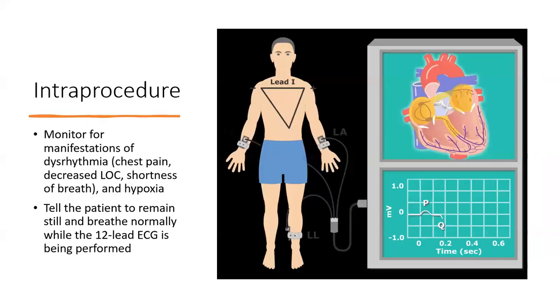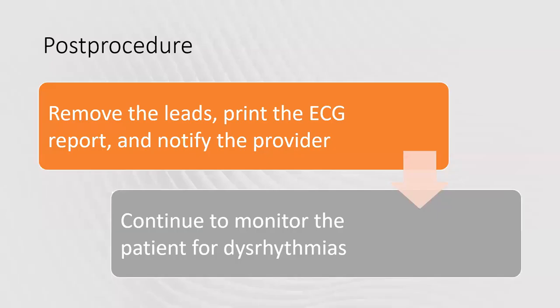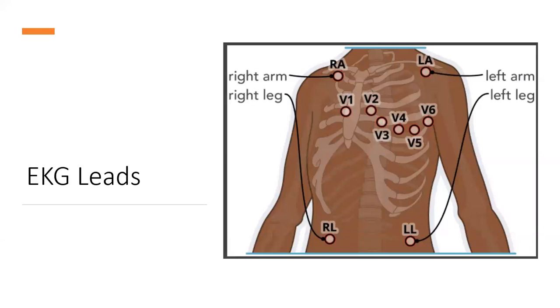So you do want to be careful with where you're placing these leads.